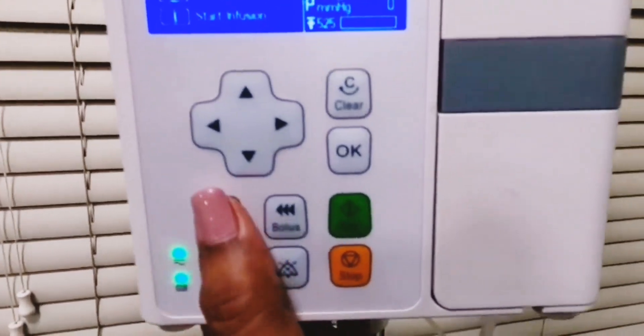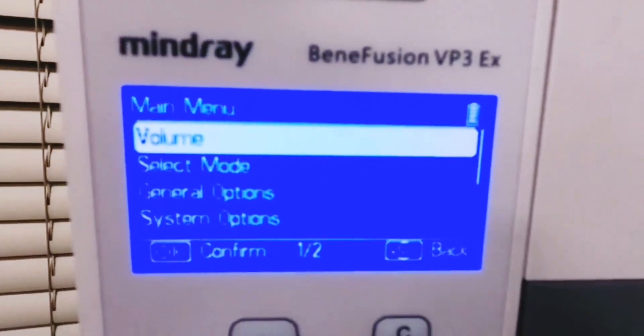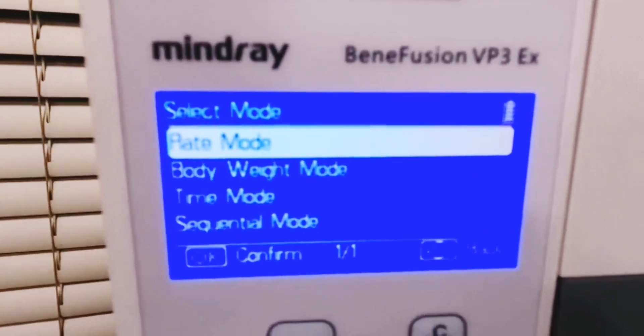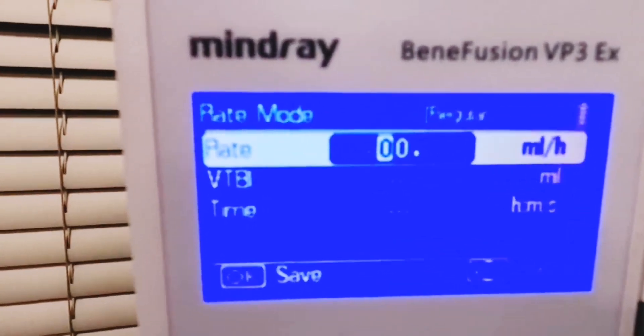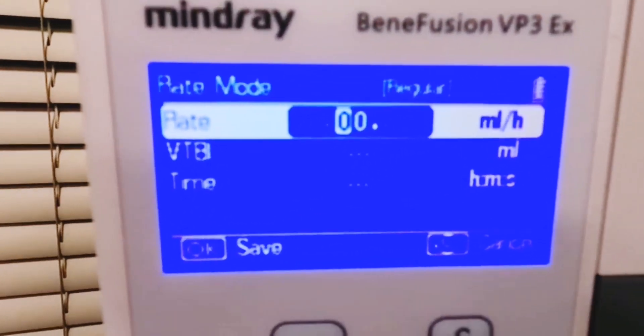We're going to return to the menu and click on select mode to choose the rate option if we are going to give drug administration. Here we can give Nexium or GTN infusion using the rates prescribed by the physician.